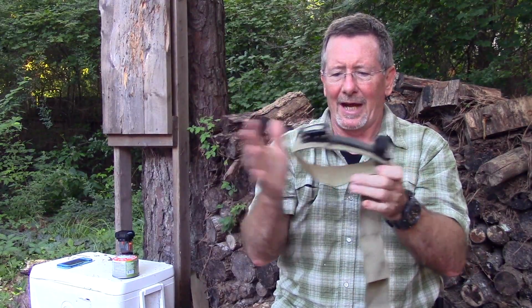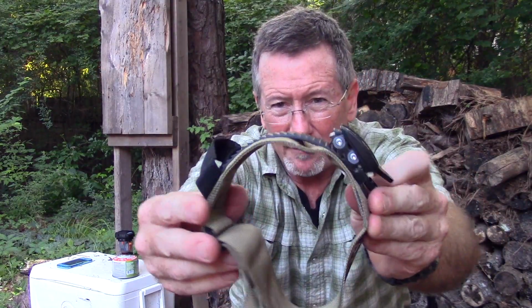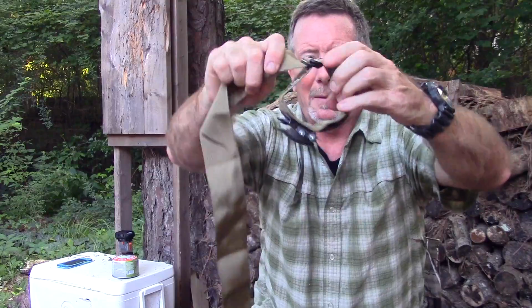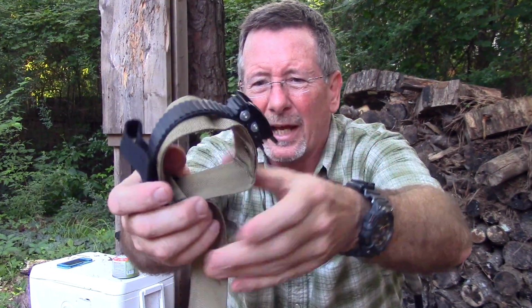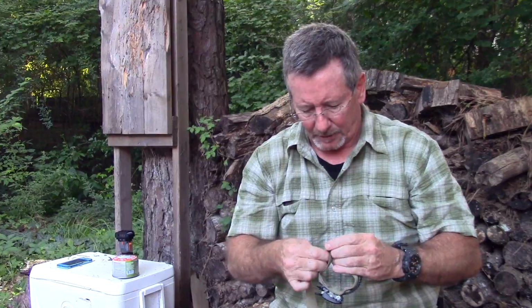The other issue that I have with this one is, for my son, when he was in the 5th grade, this probably wouldn't have worked. And so for children or even for pets, this whole mechanism here is going to limit how small you can get it. That's going to be about as small as you can get it. And honestly, some kids' arms or legs are even smaller than that. You might get a little smaller, but it's really going to be difficult. So I think it's limited to full-size adults.